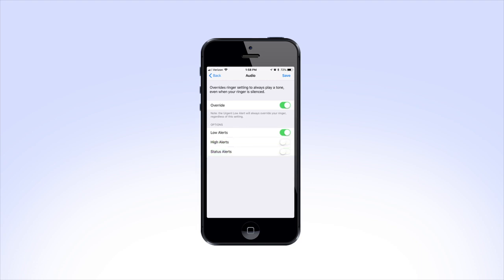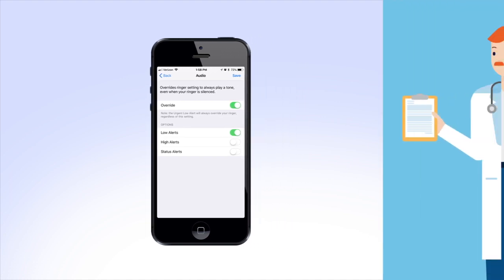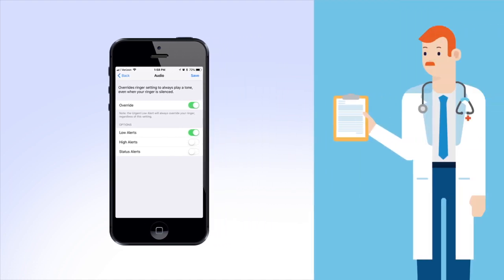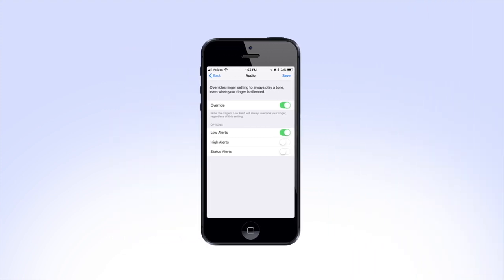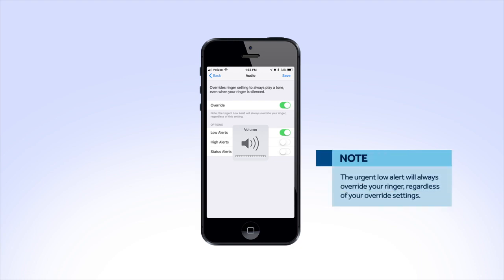Before you turn off audio override or the override setting for any alerts, be sure to talk to your health care provider to determine what setting is best for you. If you do decide to turn off audio override, it is recommended to set your mobile device's ringer volume high enough so that you can always hear your Guardian Connect alerts. Note that as long as Guardian Connect notifications are on, the urgent low alert will always override your ringer, regardless of your override settings.